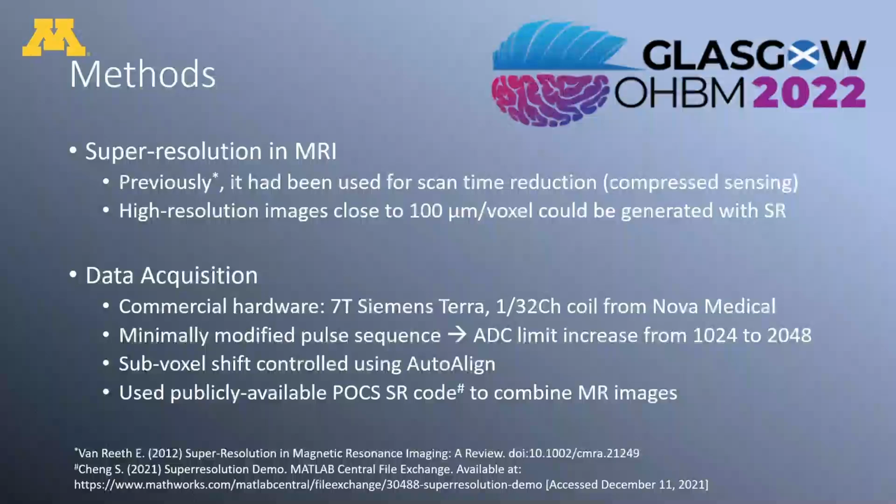Just to note, these technologies had already been used in MRI before, about 10 years ago, but mostly for scan time reduction in compressed sensing. So I wanted to use this for pushing the spatial resolution.